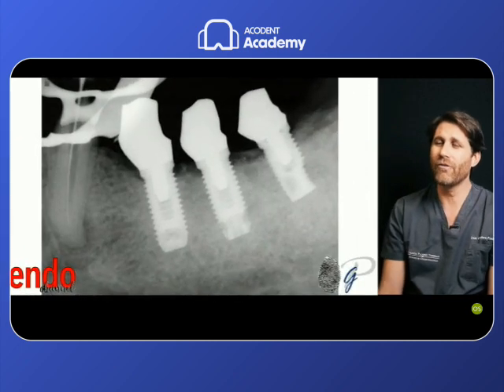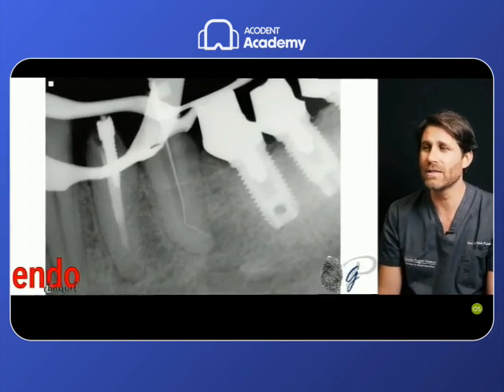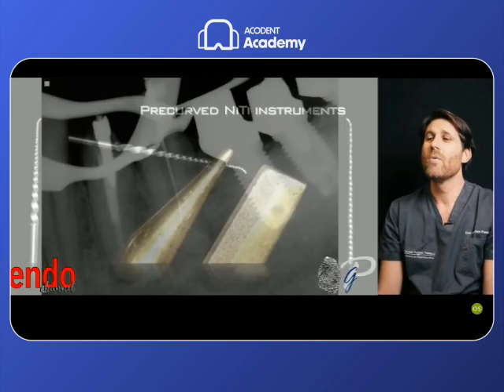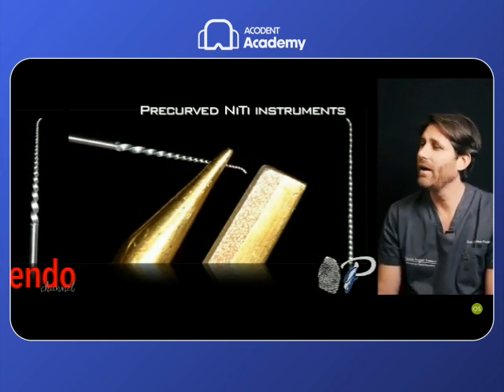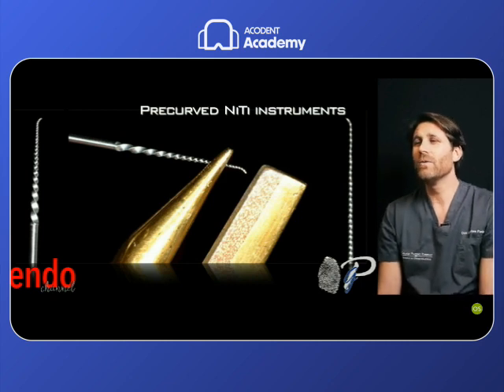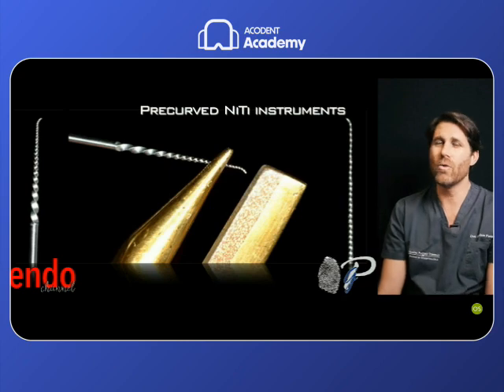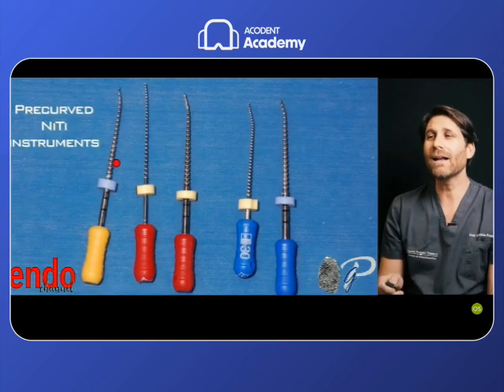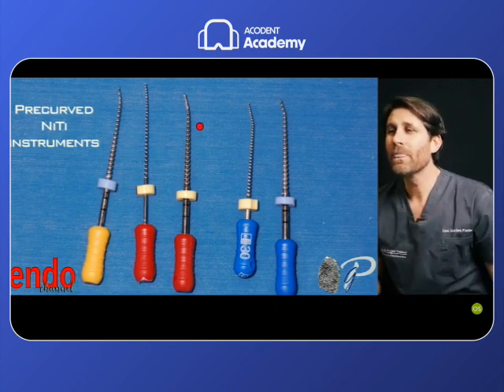This is a case of a ledge in a retreatment. It cannot be scouted by hand file over this point, but just by precurving the small stainless steel file, we go over the ledge, we overcome the ledge. We can precurve the nickel titanium instruments with specific pliers or orthodontic pliers or anything you have in your armamentarium. So I like to precurve the nickel titanium .02 Nitiflex and the nickel titanium tapered files.